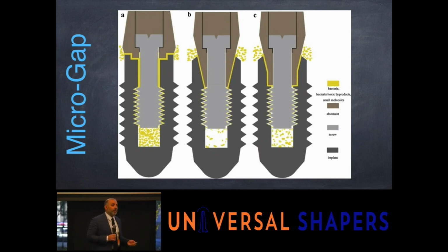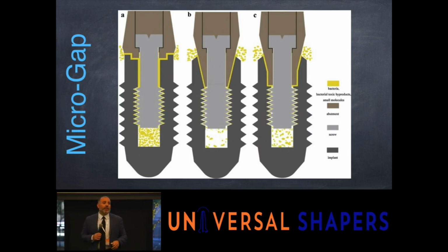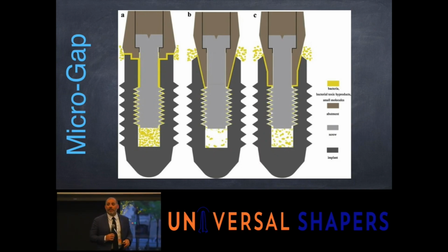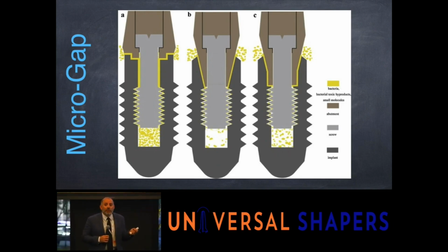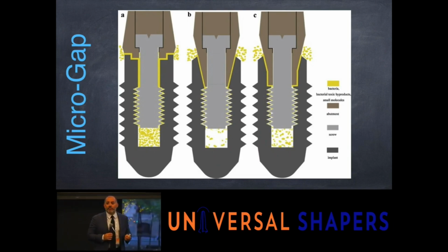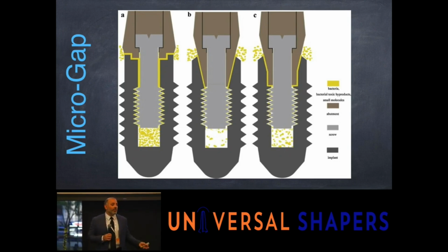And we can blame bacteria all we want, and we should, because we should be using implants that have a great seal. When you have a healing cap, if you use PRF or some type of poncho technique with collagen, and you put that into an implant, then you come back 3-4 months later and you unscrew it and you still see that PRF or that collagen. It looks exactly the same as the day that you put in that healing cap. You know you have a solid implant that has a great connection because it's preventing bacteria from coming in and degrading that material. And I see that all the time with my implants.